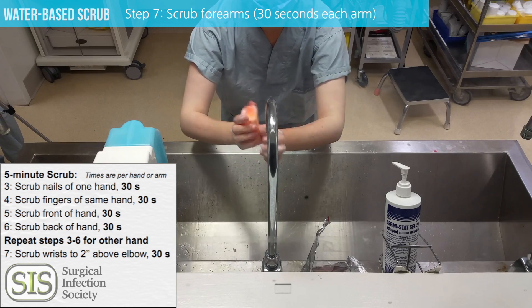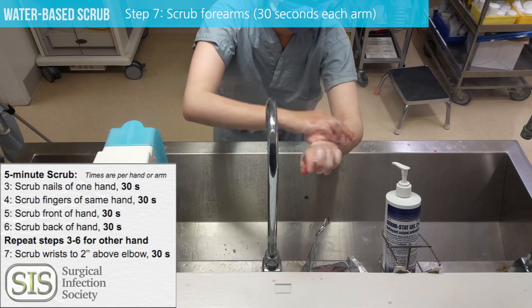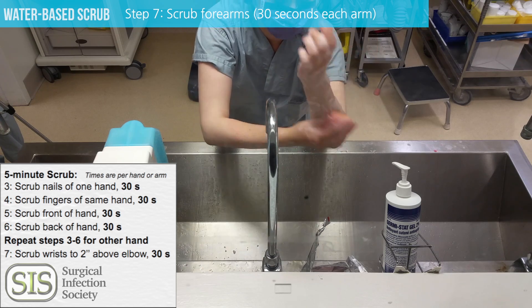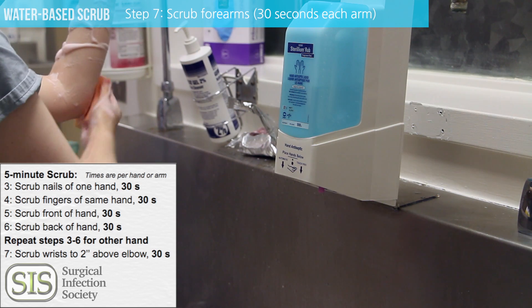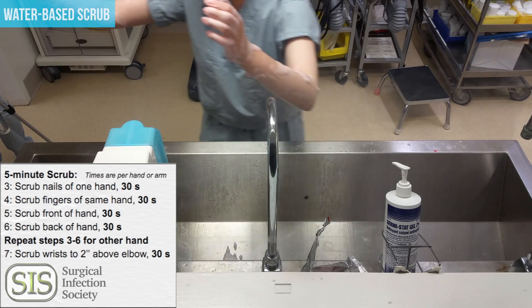Now you're ready to go on to the forearm. This is 30 seconds whether it's the first scrub of the day or subsequent scrubs — always 30 seconds on your forearm. Start at the wrist and go all the way down to two inches past the elbow. Discard your sponge.